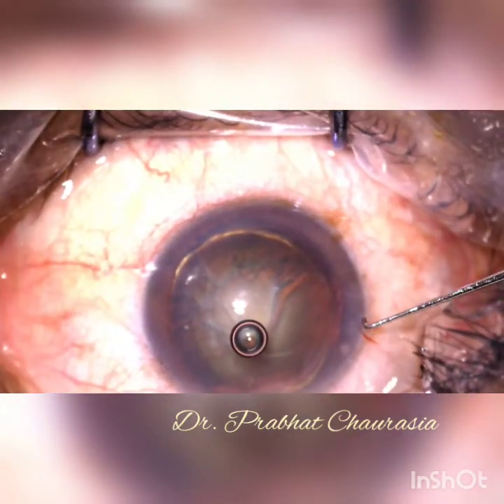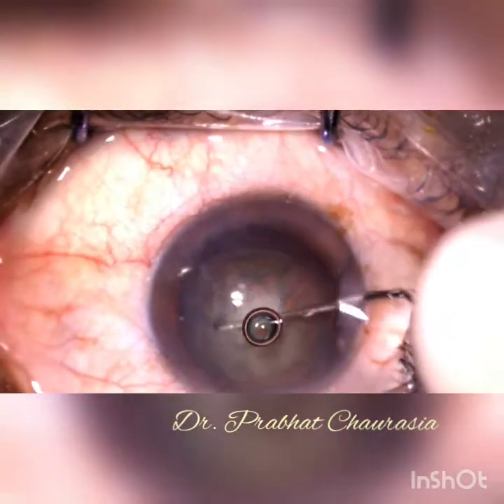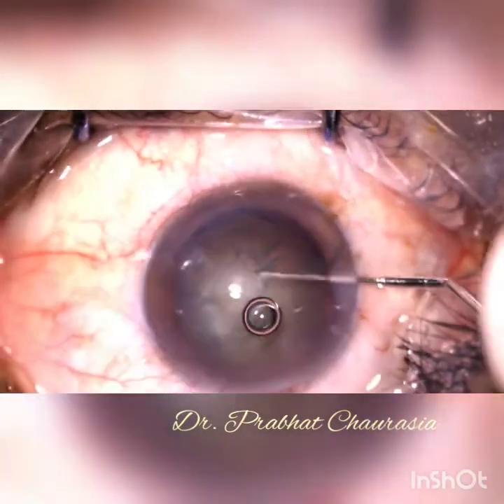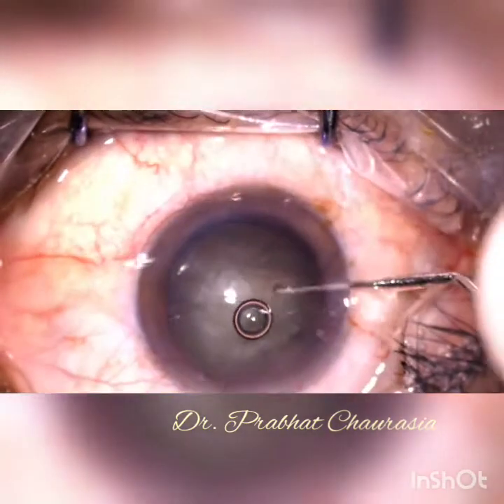Now inject some HPMC and then rotate the nucleus. Notice this free rotation of the nucleus — it indicates there are no corticocapsular adhesions.